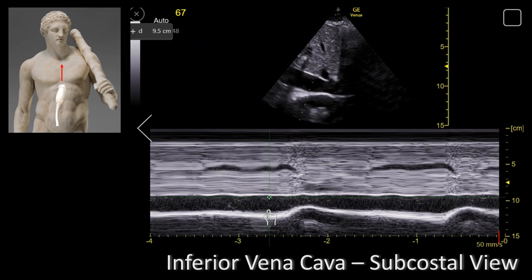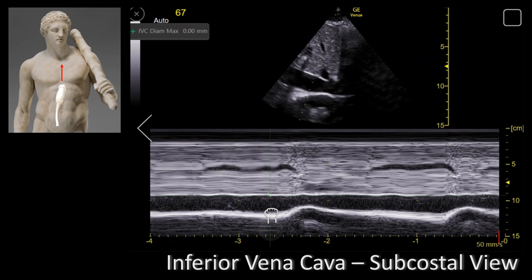Let's make some measurements. In a spontaneously breathing patient, during inspiration the blood flow increases into the right heart and as a result the inferior vena cava diameter decreases. To standardize measurements, ask the patient to make a quick inspiratory effort or a sniff. We can measure the IVC respiratory changes and use them to predict the right atrial pressure. The diameter of the IVC should be measured perpendicular to the long axis, and we use M-mode for precise measurements.